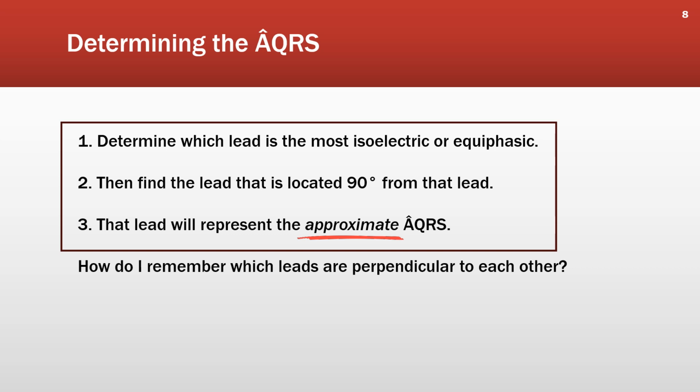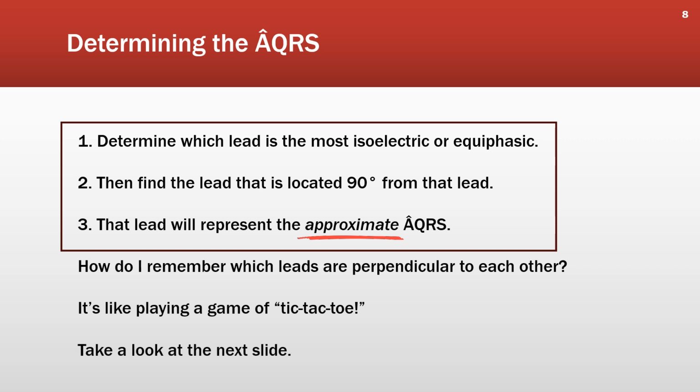So how do I remember which leads are perpendicular to each other? Or how do you remember? It's like playing a game of tic-tac-toe. So we'll take a look at the next slide.